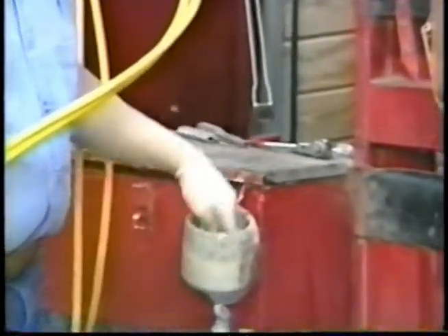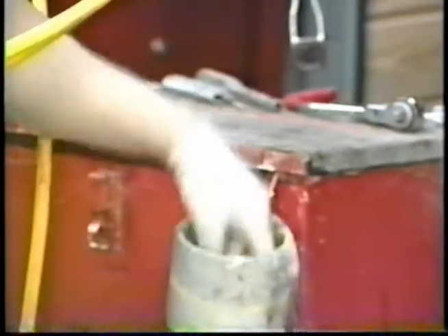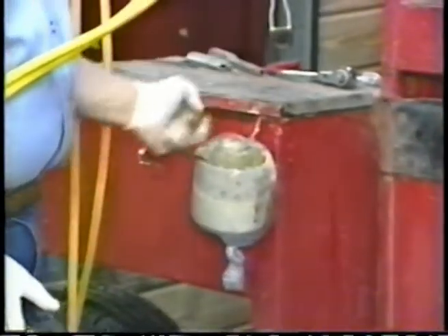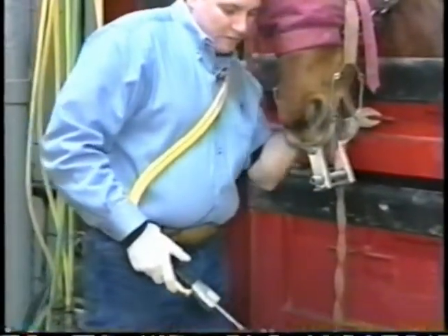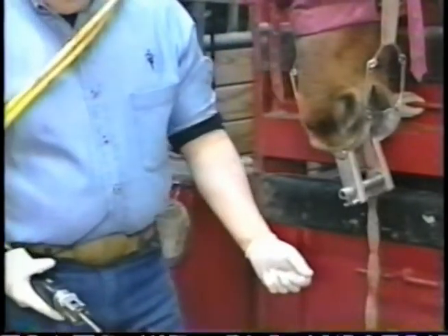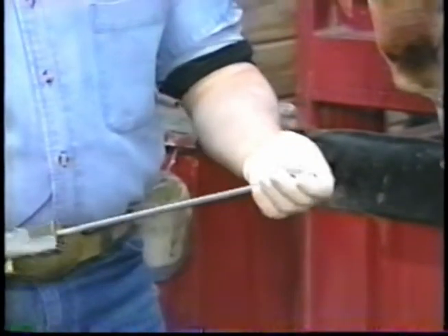We use a lot of lubrication with this style of dentistry. The reason we do is that, for both the operator and the horse, it helps alleviate friction or burns inside the mouth. That's due simply to the vibration — the instrument moves at about 6,000 oscillations per minute and has less than a three-eighths of an inch stroke.